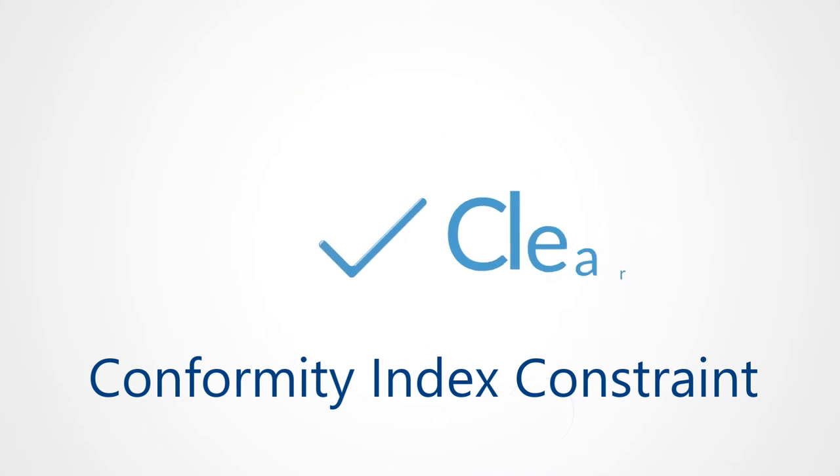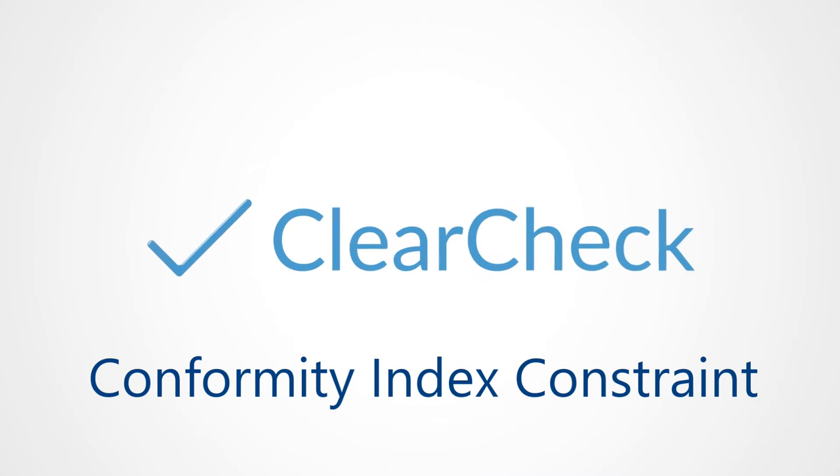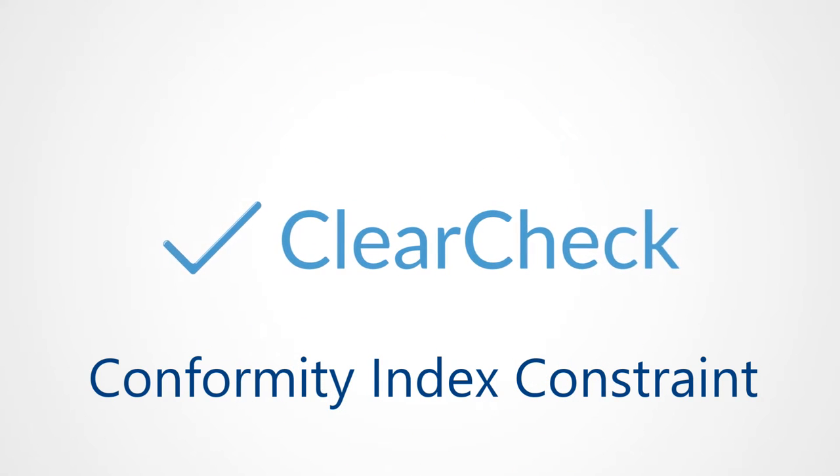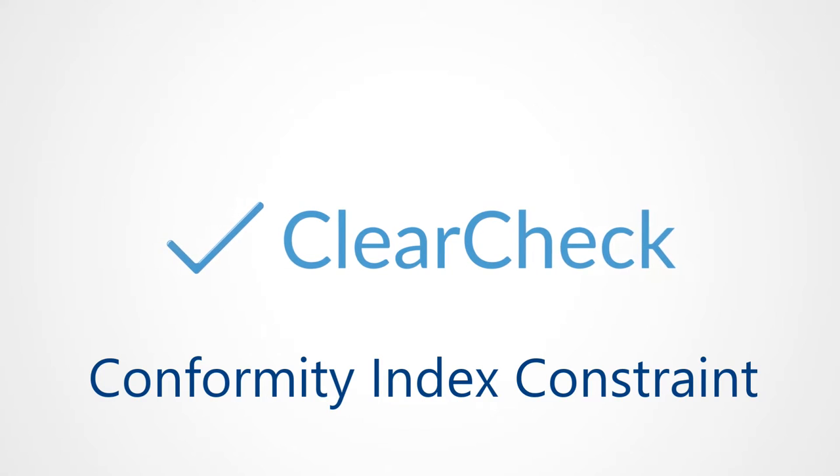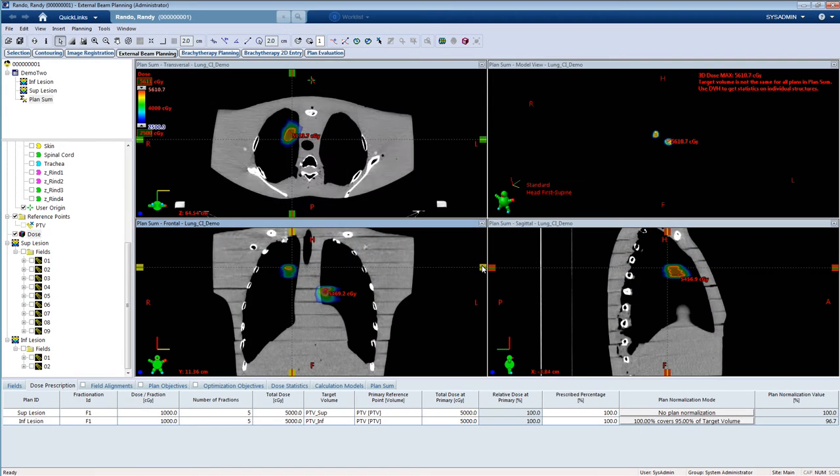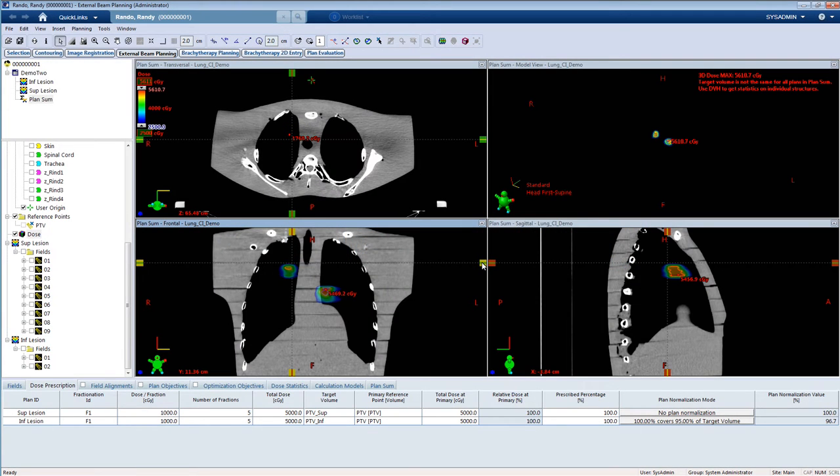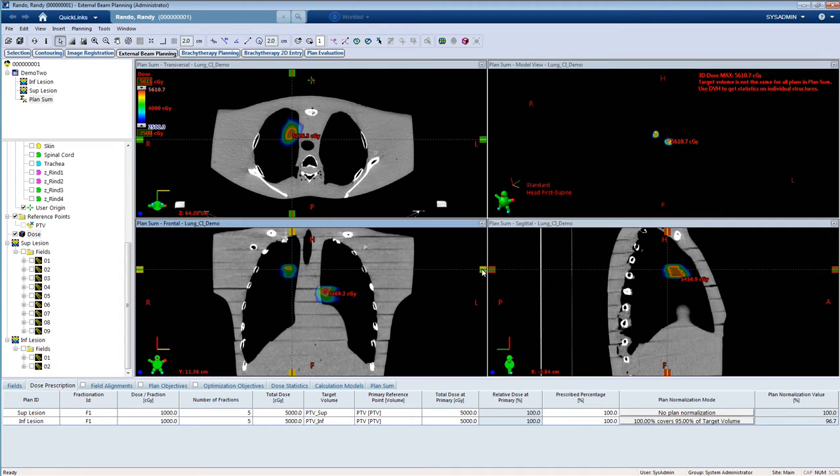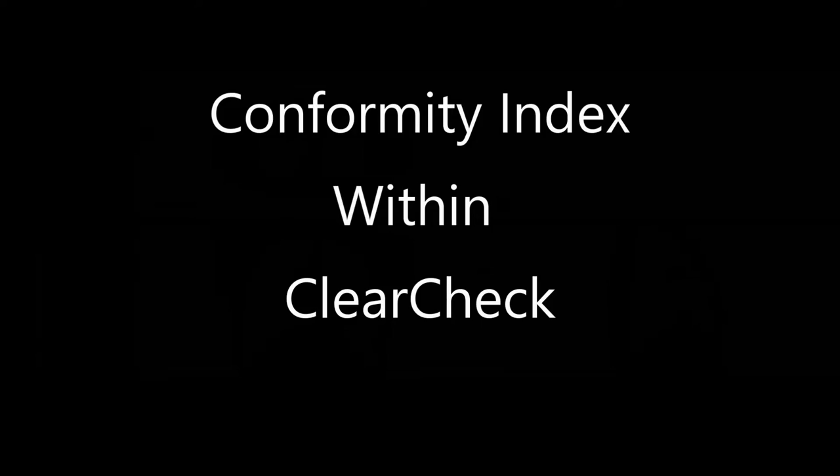Hello and welcome to an explanation of the constraint type Conformity Index within the ClearCheck software. In this video, we will go through step-by-step how this constraint type works. We will eventually use the constraint type with an SBRT lung case. Let's get started.